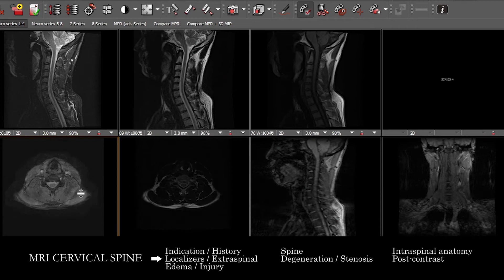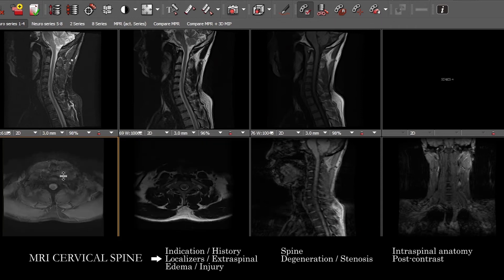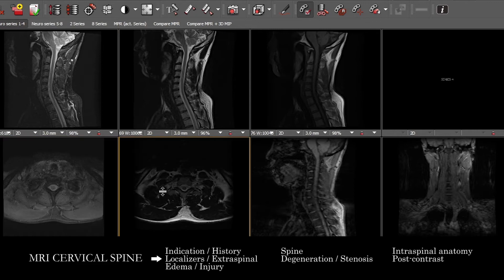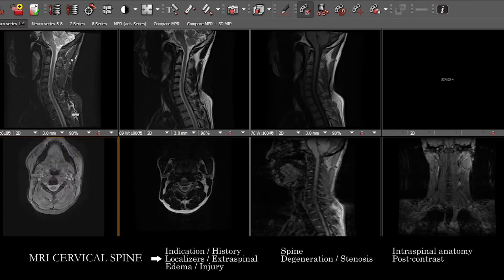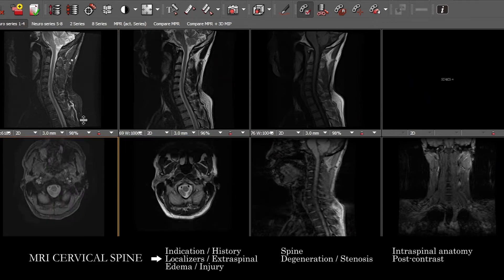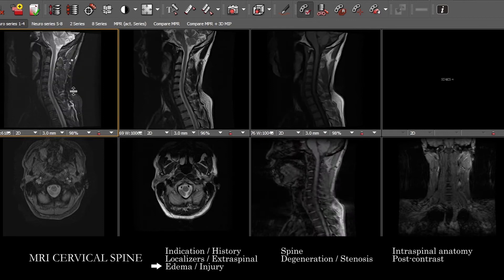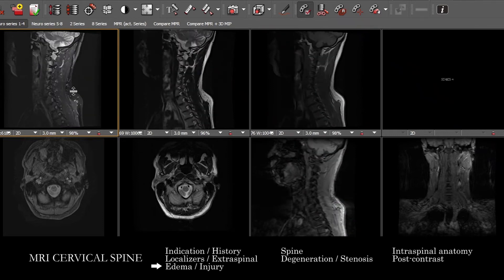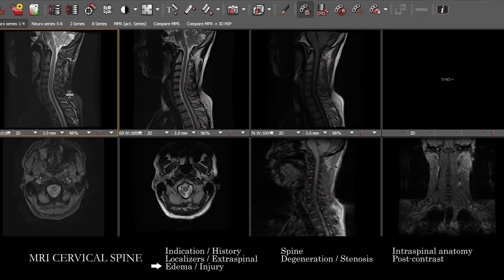Just note that you can see a lot. You're frequently going to see nodules in the thyroid gland. You can see the neck vasculature here and follow that down into the upper chest. So just make sure we're looking at each of those in turn, and then once you've gotten a good sense that you've at least taken a look at the extra-spinal anatomy, move on to the actual spine itself.